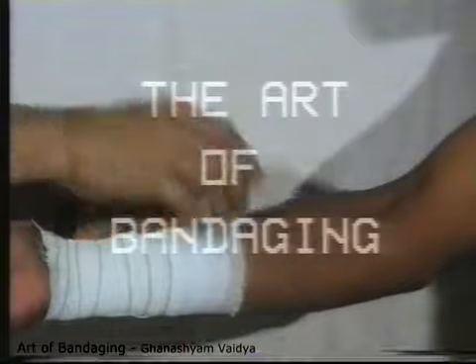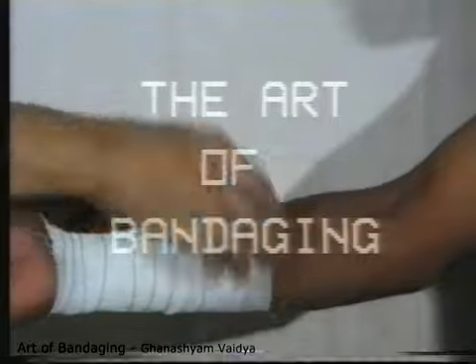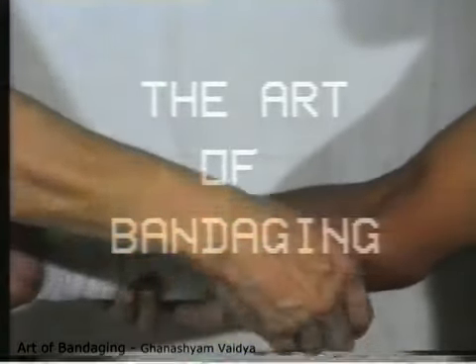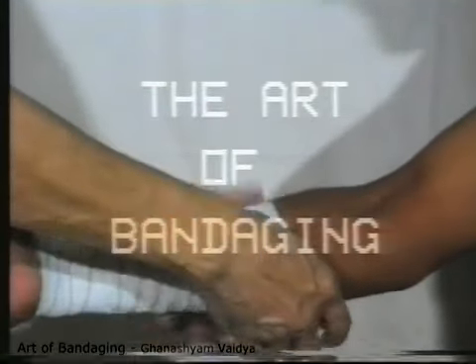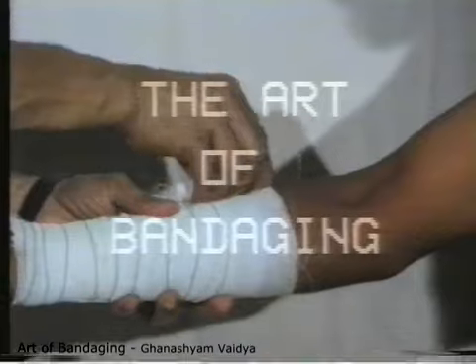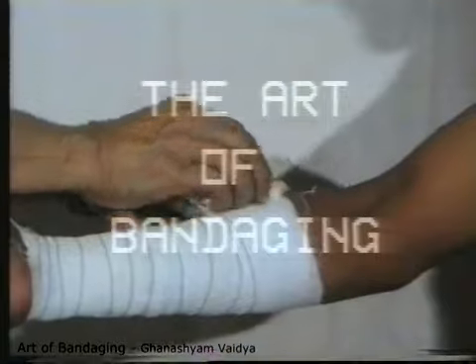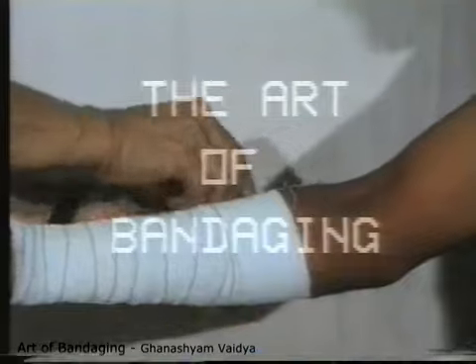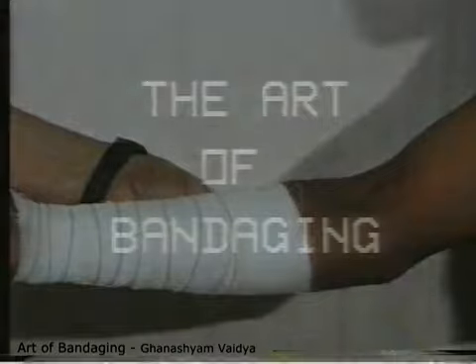In this class, we will be studying the techniques of application of the commonly used cotton roller bandages to various parts of the body. We will also look at various other types of bandages and their specific uses. The art of bandaging has been demonstrated by late Dr. M. K. Vaidya, a master surgeon who considered the art of dressing and bandaging as important as operative techniques. Let us first study the various uses of bandages.